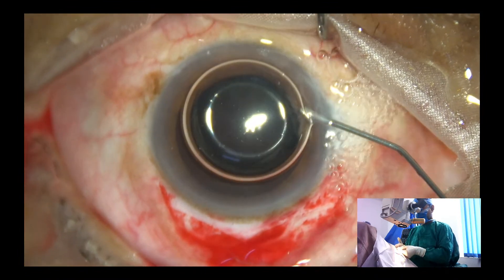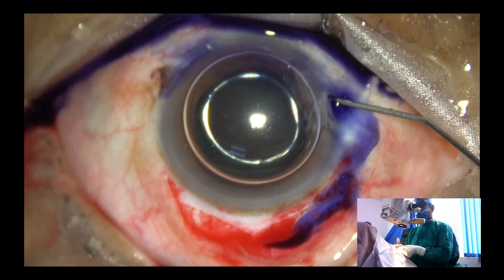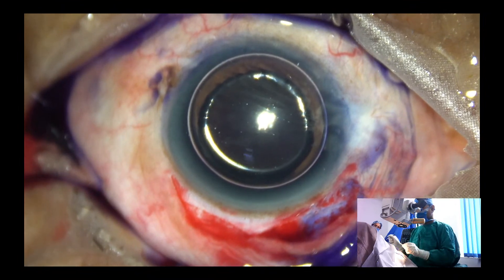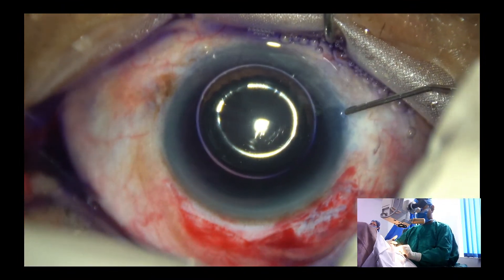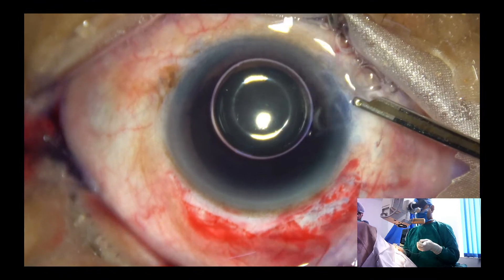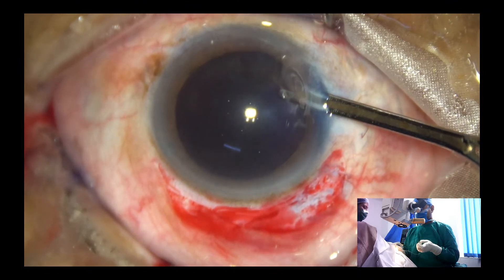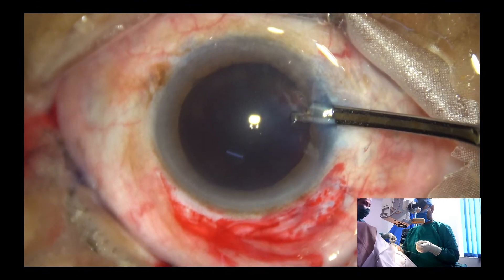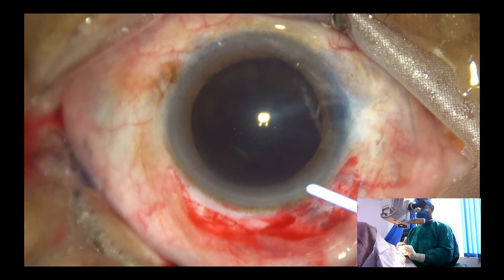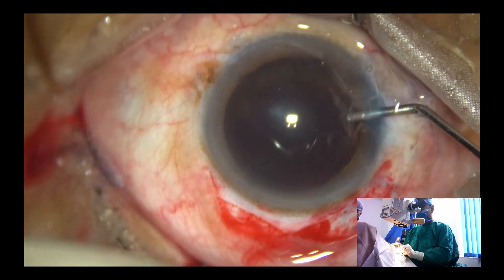The anterior capsule is stained with Trypan Blue. This is adrenaline — the pupil has dilated well. Just maintain the dilation; you can apply a bit of dilute adrenaline. I always wash the dye. And now, Visco — inject into the anterior chamber.